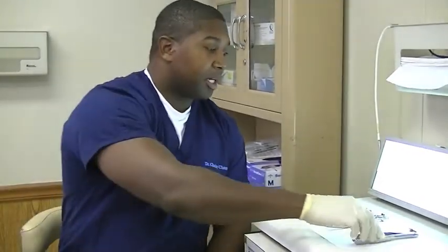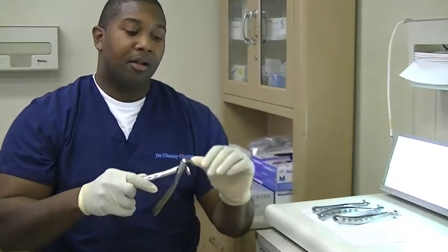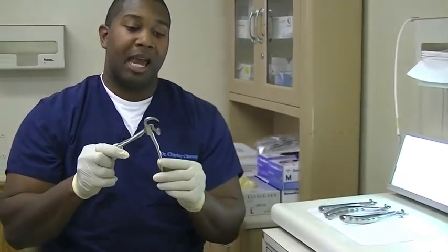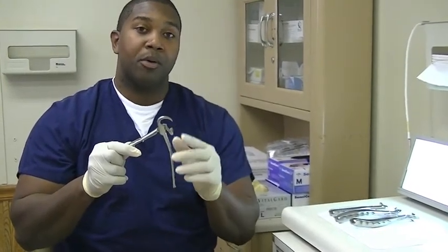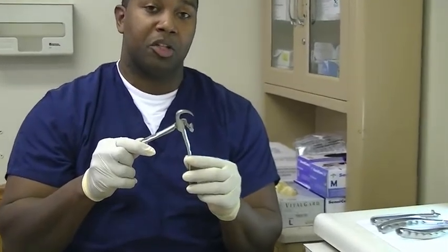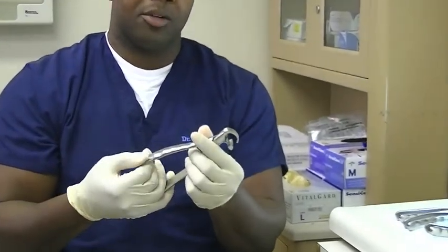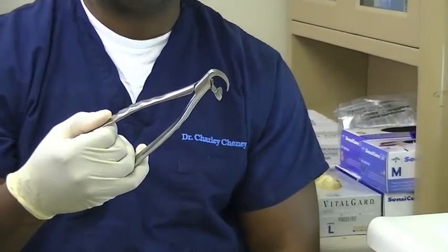With the Physics Forceps, you have 3 components of the instrument. The beak, which engages the lingual aspect of the tooth. The bumper, which is placed as deep, as far down on the vestibule as possible. And your handles, which act as the lever using Class 1 lever action.